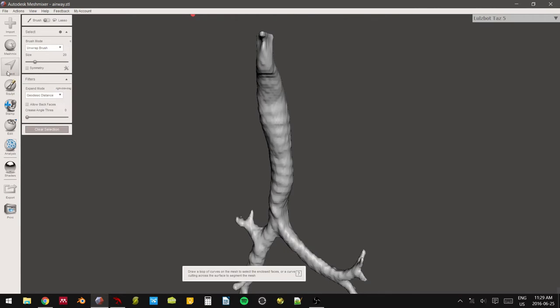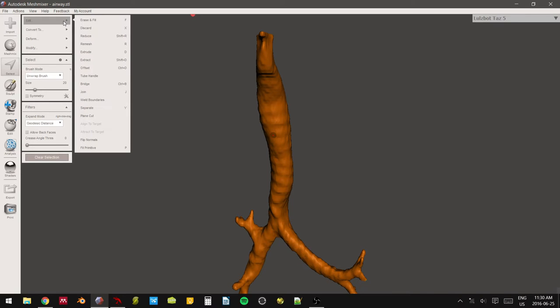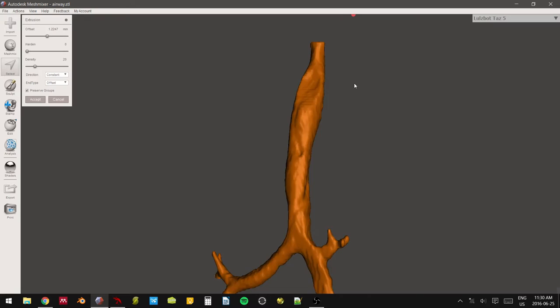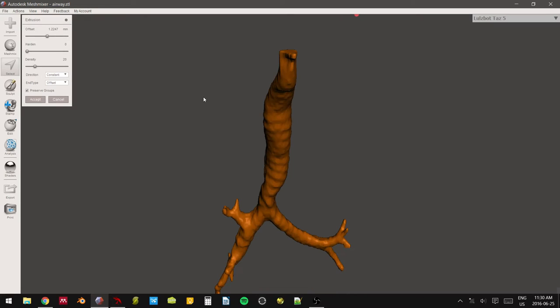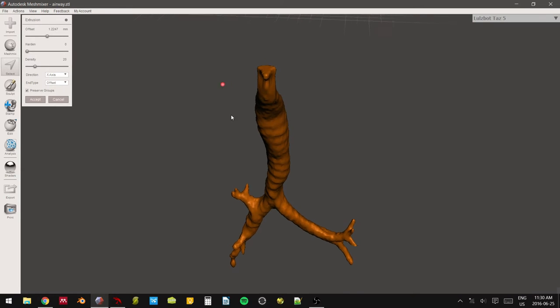To do that, we're going to go back into our selection menu. We are going to select the entire model. And with the entire model selected, you're going to go into the edit menu and then you're going to hit extrude. Extrude is basically just going to expand the entire model by a certain set amount. And you can see that set amount here in their offset. And the only things that you have to change are A, the offset amount, and B, the direction. So we can see what happens here. If we choose the x-axis, it's going to just expand it in the x-axis direction and no other directions.